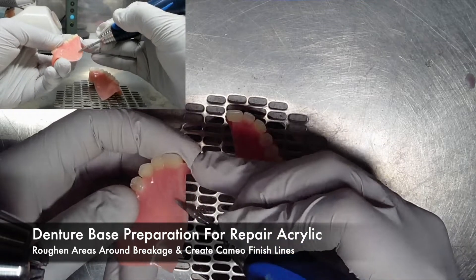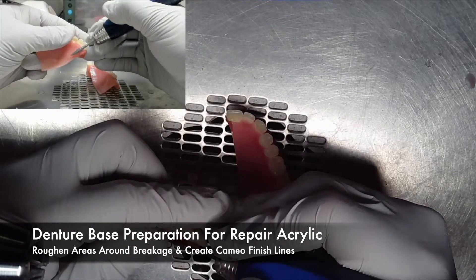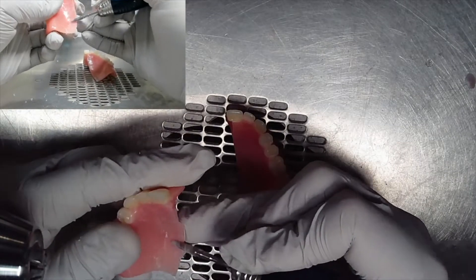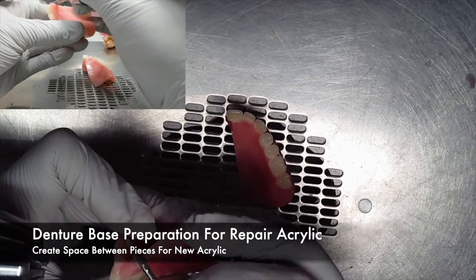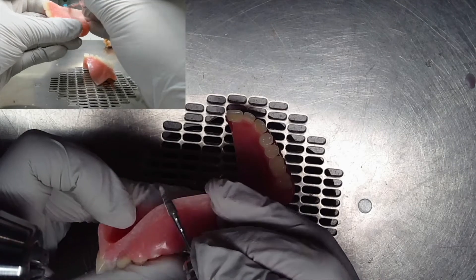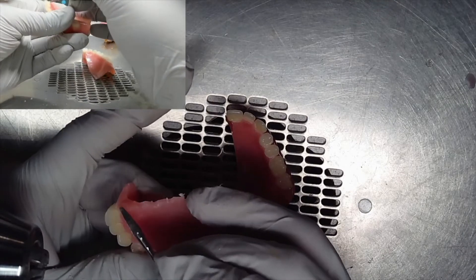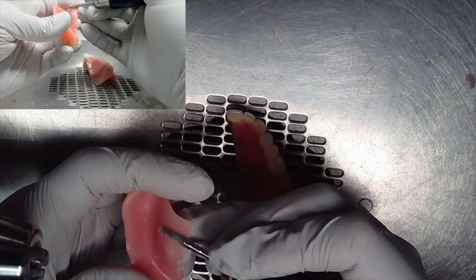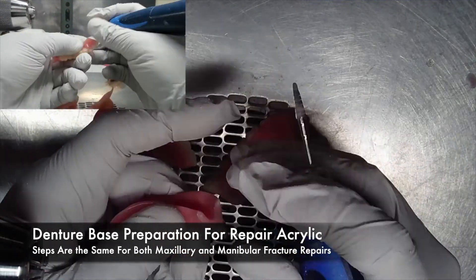The denture base now needs to be prepared for the repair acrylic. Rough the areas around the breakage and create a cameo surface finish line. This goes for both sides of the broken halves. Next, you want to create space between the two pieces for the new acrylic. Finally, be sure to create retention cuts on the prepared surfaces. All these previous steps hold true for any type of denture base fracture, whether it is on the mandibular or the maxillary.